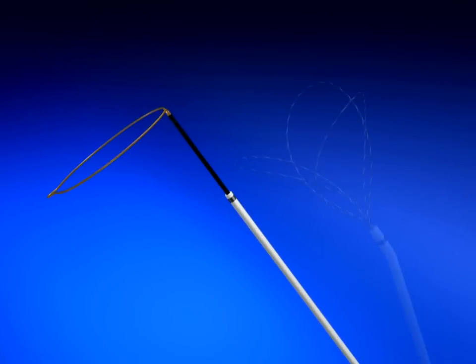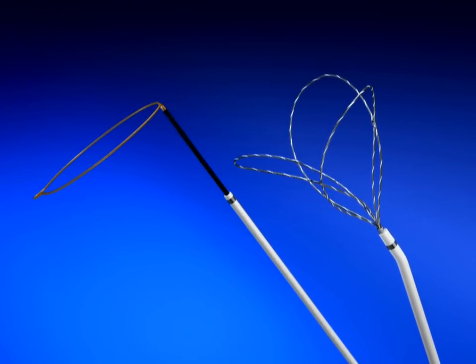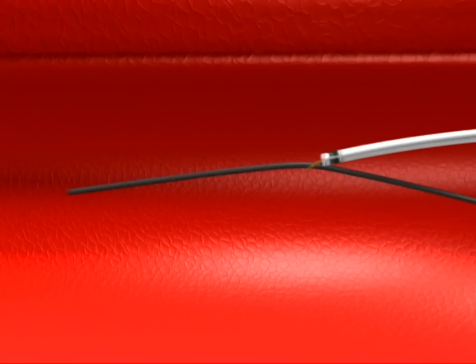The Single Loop One Snare Endovascular Snare System along with the Interlace Triple Loop End Snare Endovascular Snare System provide the options physicians need for accurate and reliable manipulation and capture of foreign objects.